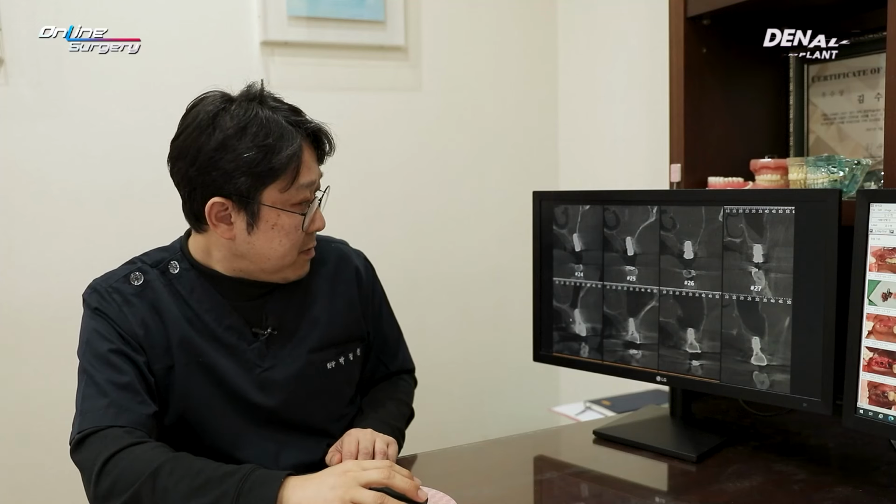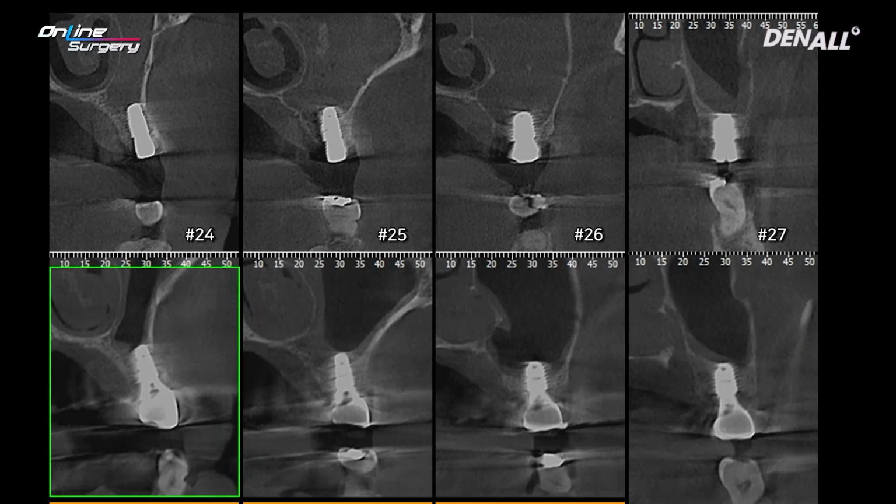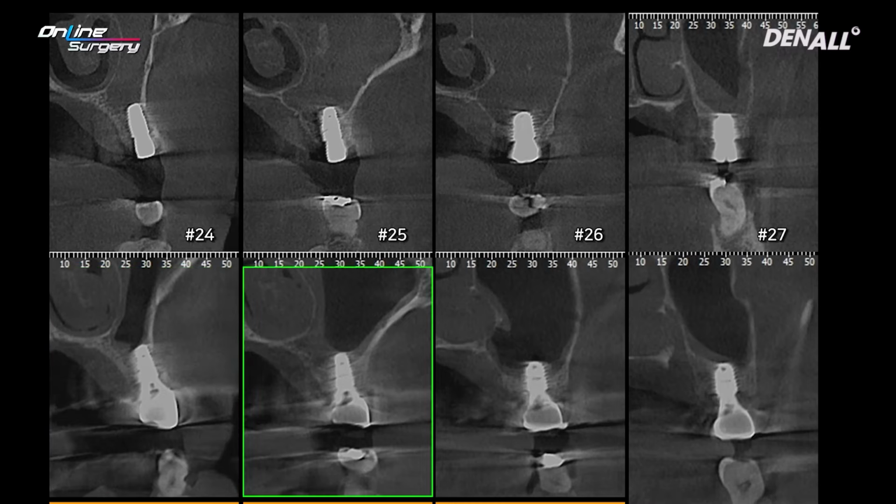When we do sinus surgery, we need to do diagnosis properly as to whether the ostium is blocked or whether it has patency. We need to look at the contour of the sinus membrane and the thickness of it. We also need to consider whether there is a possibility of the ostium being blocked. If you look at the pre-op image, there is patency in the ostium. Sinus membrane was perforated and graft material was put in, but fortunately healing was done nicely. If the ostium is blocked, or if there's irregularity in the sinus membrane, or excessively thick membrane, you can come across significant difficulties.